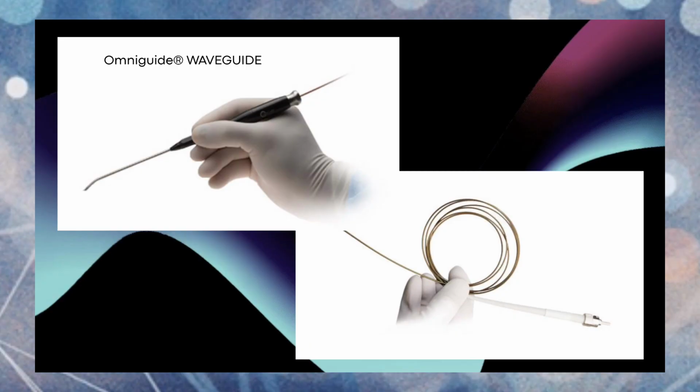Even the microscope itself is protecting you. It's not bouncing through the light of the microscope, the lenses of the microscope. But when you use this fiber, this energy is not going in a straight linear fashion like it does out of the micromanipulator. It is bouncing off of the waveguide in a curved fashion, and then when it exits the waveguide, because it doesn't dissipate, it's not absorbed by the silica very well, so it maintains its energy.